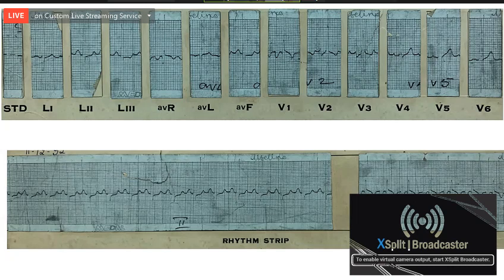Okay, then what else? Why did you diagnose RVH? The amplitude of the R wave in V1 is 7 millimeter. Yes, there is a QR pattern in V1, with a small Q and an R pattern. There is no S wave at all. That's okay. And R by S is the criterion applied for diagnosing right ventricular hypertrophy. Yes, what else?